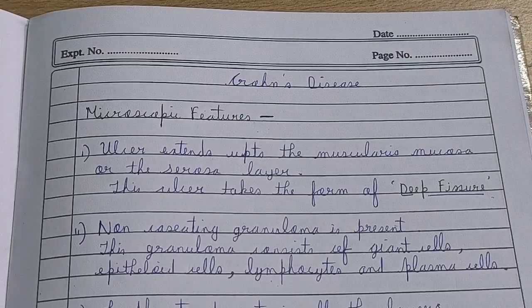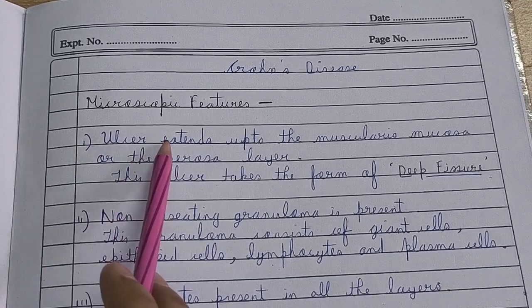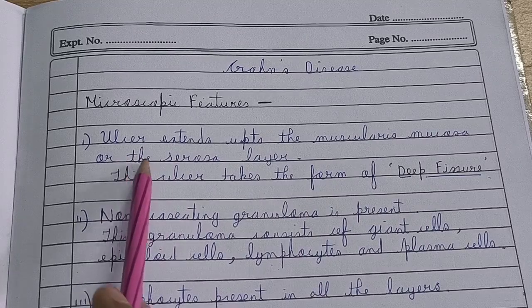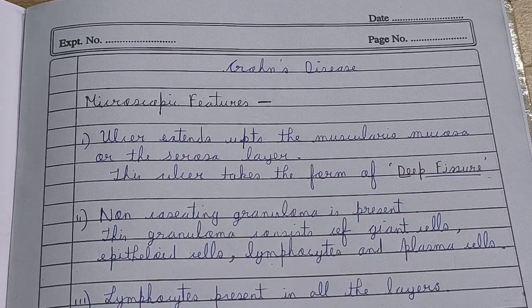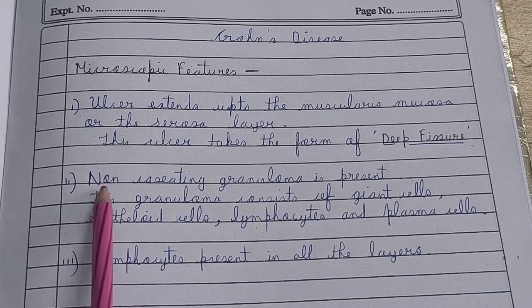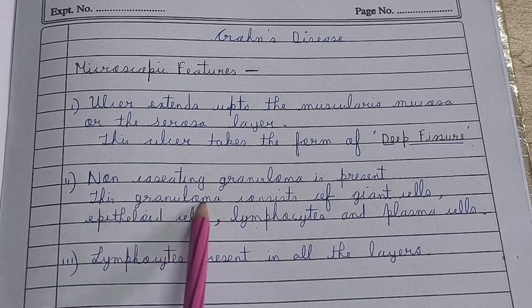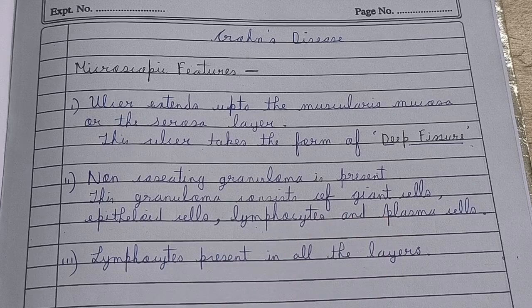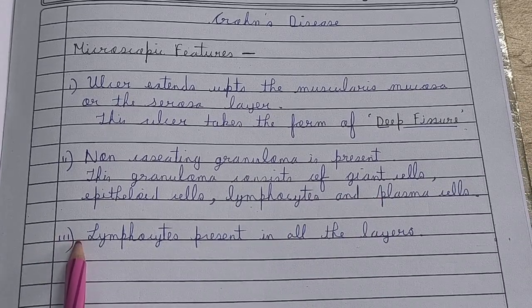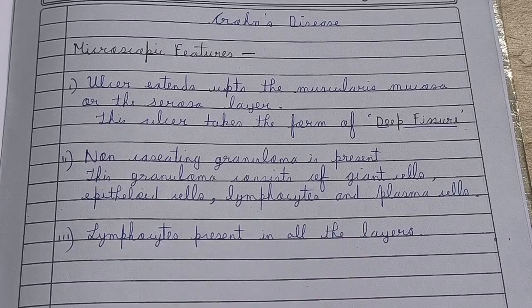So see what I have written. The microscopic features: the first thing is that the ulcer extends up to the muscularis mucosa or the serosa layer, and this ulcer takes the form of a deep fissure. Second, a non-caseating granuloma is present, and this non-caseating granuloma consists of giant cells, epithelioid cells, lymphocytes and plasma cells. And the third thing is that lymphocytes are present in almost all the layers. So these are the histopathological findings of Crohn's disease.